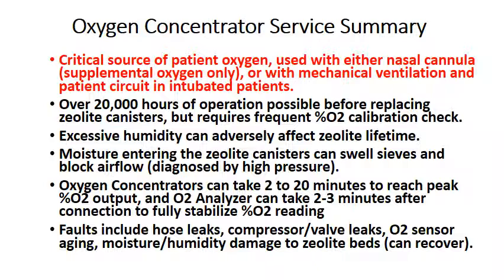Now, over 20,000 hours of operation is possible before replacing the zeolite canisters, but that requires frequent O2% calibration checks. Excessive humidity can adversely affect zeolite lifetime, and moisture entering the zeolite canisters can swell the sieves and block airflow, which can be diagnosed by high pressure at the input to the sieve beds.